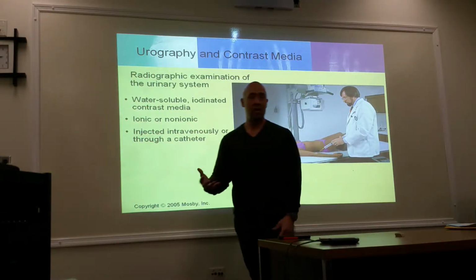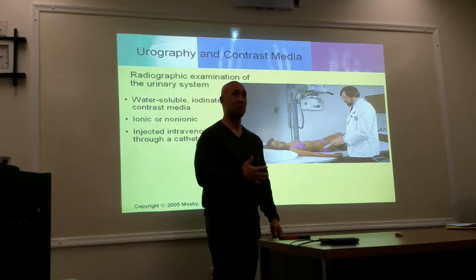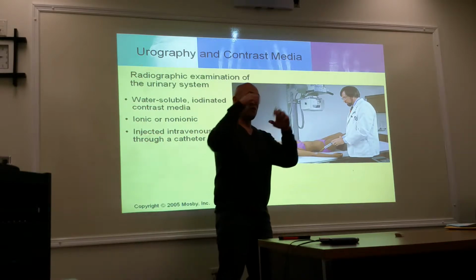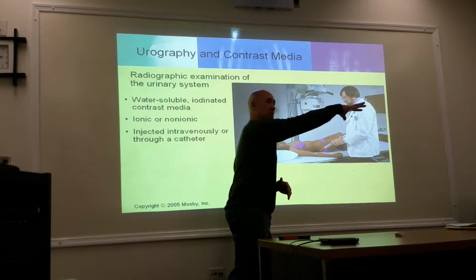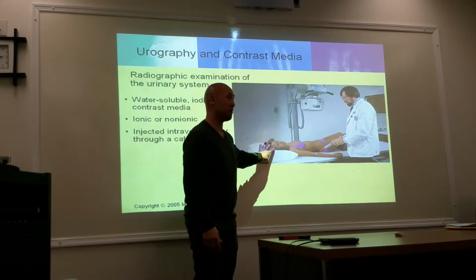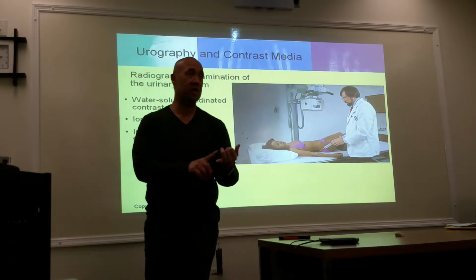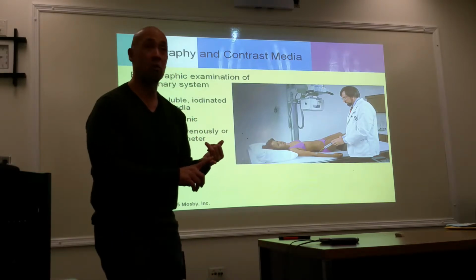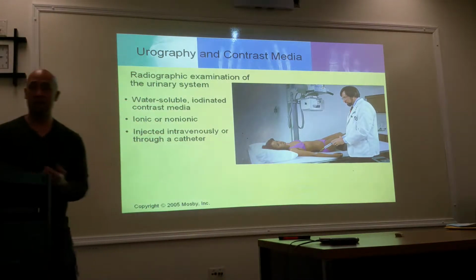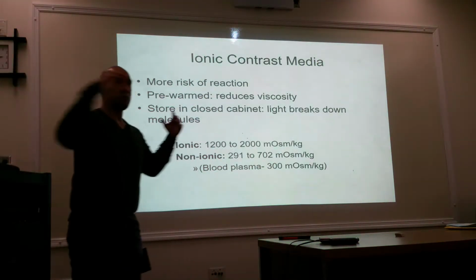You can see it a little bit more. But what they also found out was the patient was getting unnecessary radiation exposure because CT produces a lot of x-rays. So they took it away from diagnostic radiology, put it into CT, and now it's making its way back into the radiology department again. So now you're going to be seeing an increase of technologists performing these IVUs, which stands for intravenous urogram, or IVP, which stands for intravenous pyelogram. IVU or IVP. Okay.